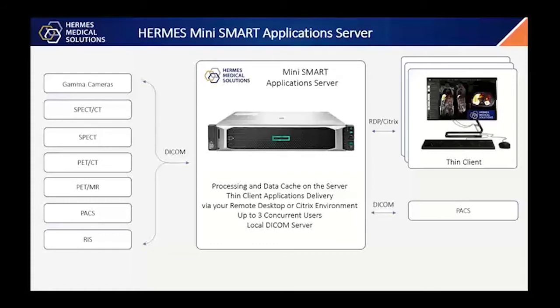It's a mini smart application server. As the name suggests, it has a DICOM server built into it. Like the workstation, it has all the capabilities within this box, but you don't access it directly. You would access it on a thin client basis, sitting at a trust computer or a hospital computer, for example.